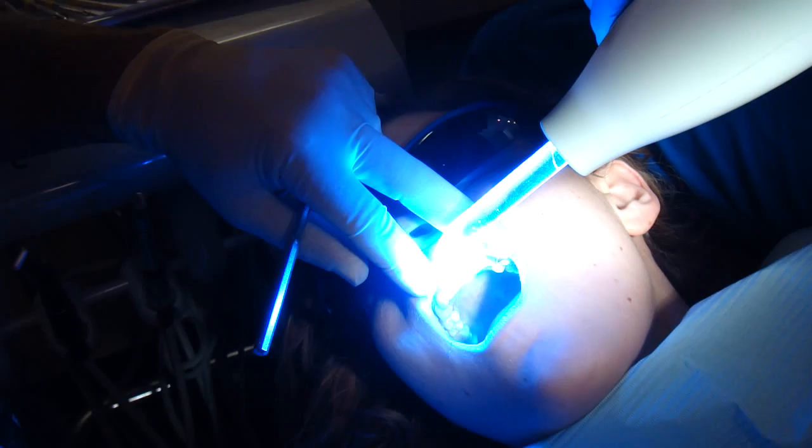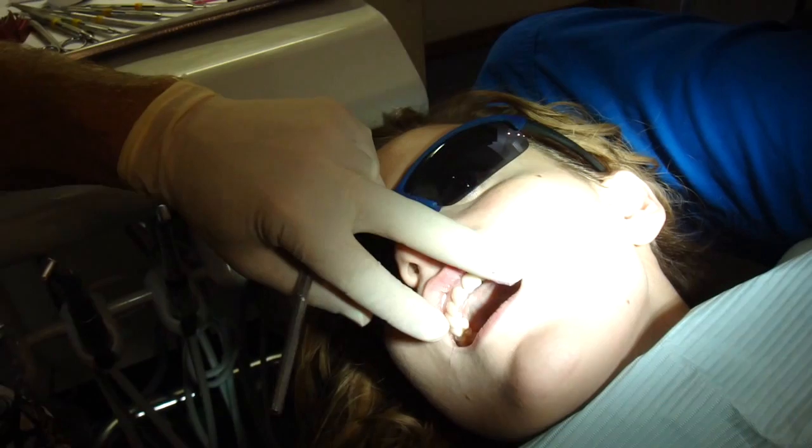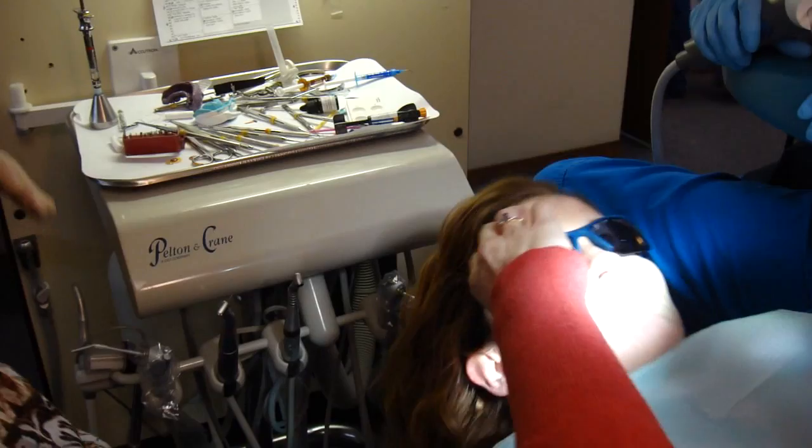Okay, hit that with a light. Okay, there's your temporary veneers. You can go ahead and take a peek in the mirror. You might want to take your glasses off to be able to see them.